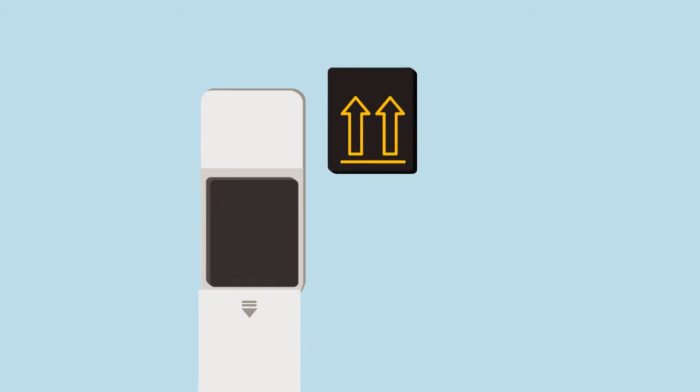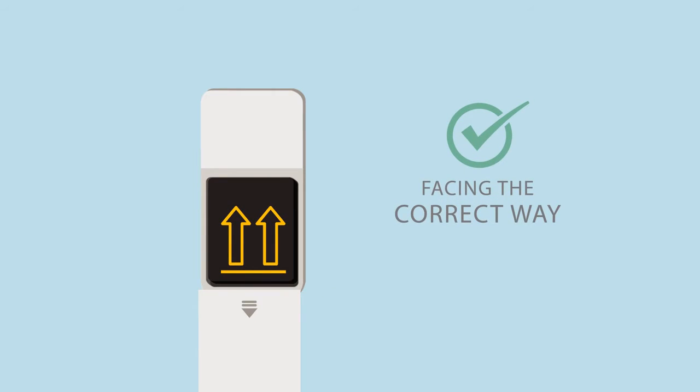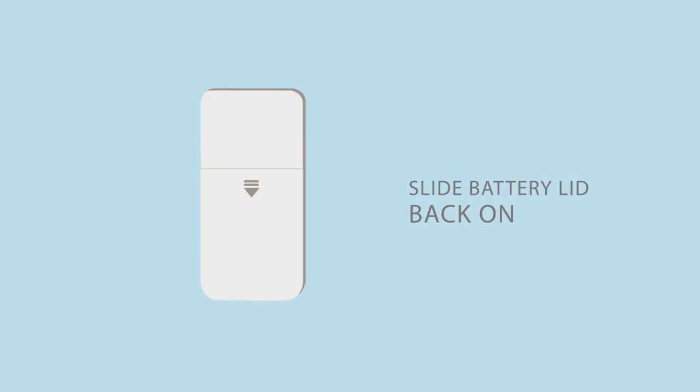Take the battery and insert it into the case. Make sure that the battery is facing the correct way. Slide the battery lid back onto the oximeter. You'll hear it click into place.